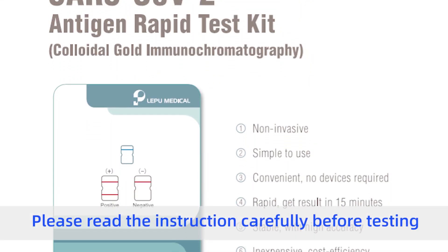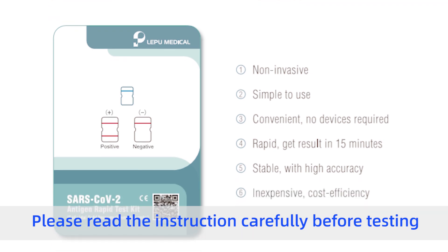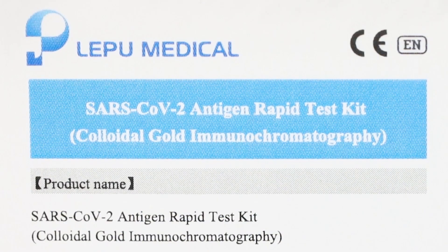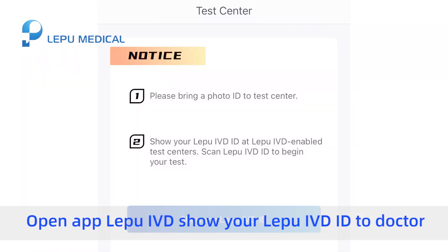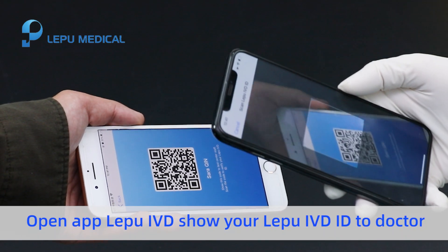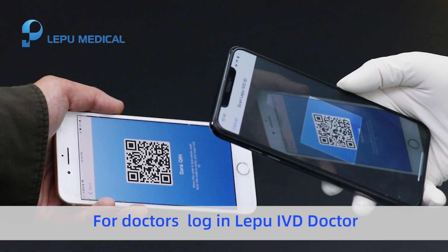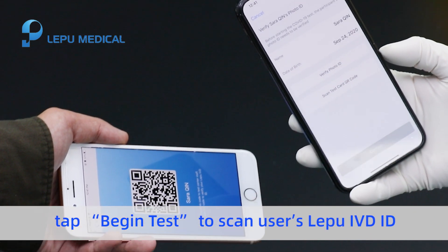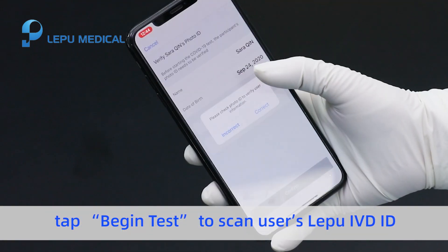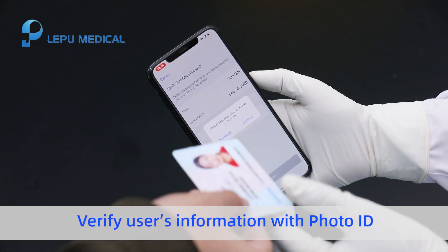Please read the instructions carefully before testing. Open the Lepu IVD app and show your Lepu IVD ID to the doctor. For doctors, log in to Lepu IVD Doctor and tap 'Begin Test' to scan the user's Lepu IVD ID. Verify the user's information with photo ID.